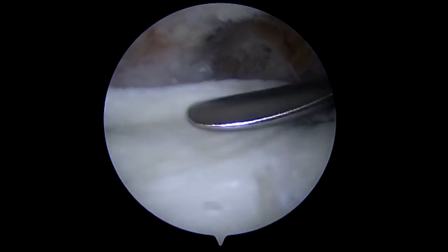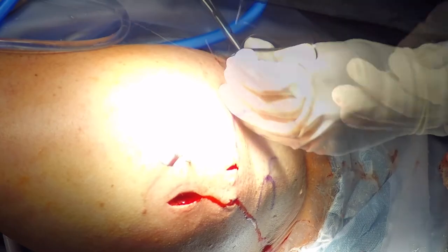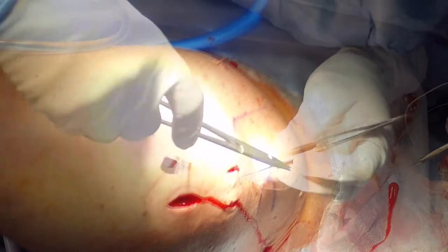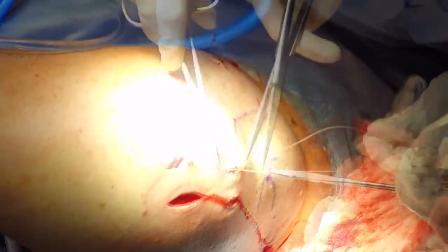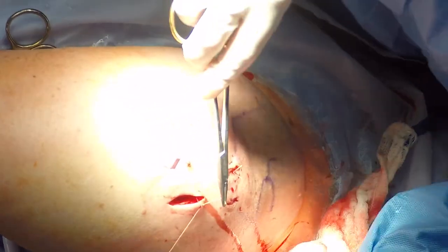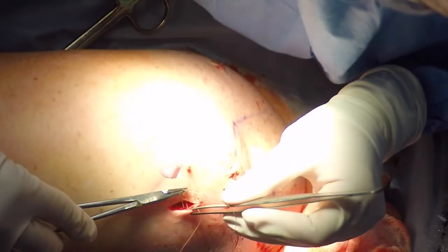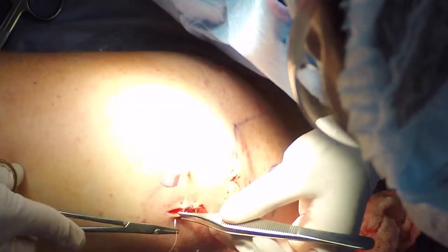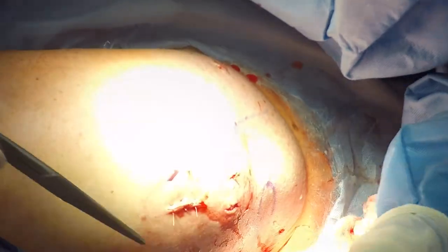We will then close the portals. This is the posterior portal. Those were superior micro portals used to simply insert the medial row of the swivel lock anchors. The lateral portal is a bit larger because of the working cannula to pass the graft. These are absorbable sutures that we tend to use in our arthroscopies — there's really no need to remove sutures. Patients appreciate that and it's a good time saver. This is a 3-0 micro type suture.